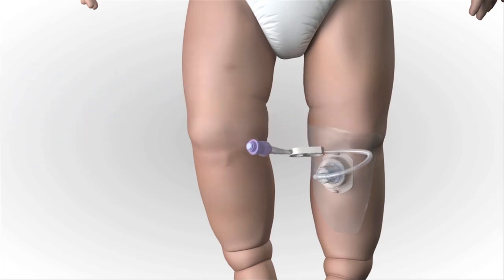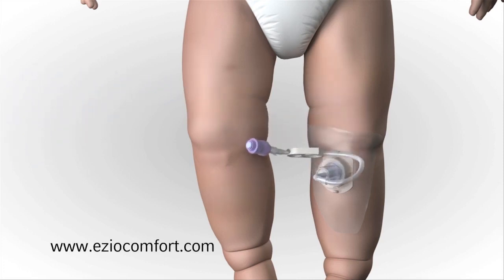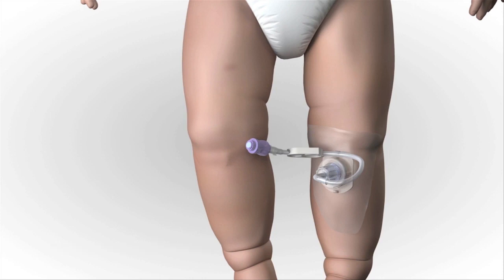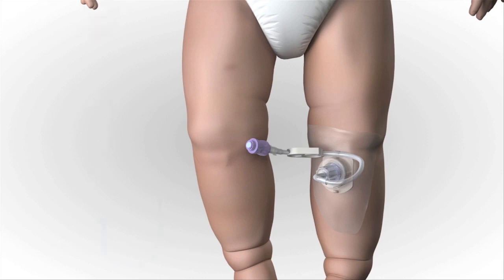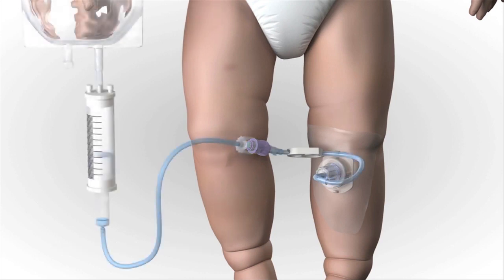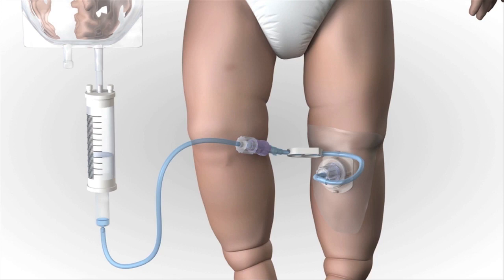For patients responsive to pain, please visit www.eziocomfort.com for additional information. Connect fluids if ordered. Infusion may need to be pressurized to achieve the desired rate. Assess frequently for any signs of infiltration, extravasation, or other complications.